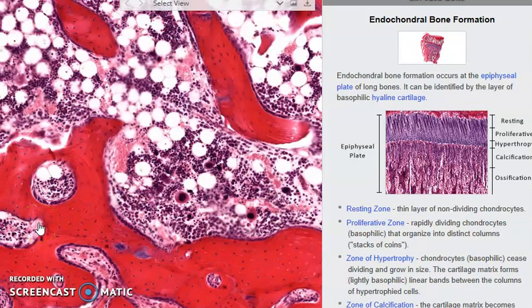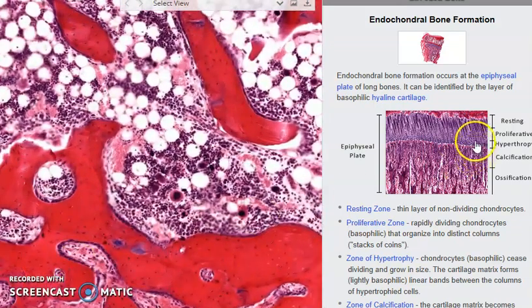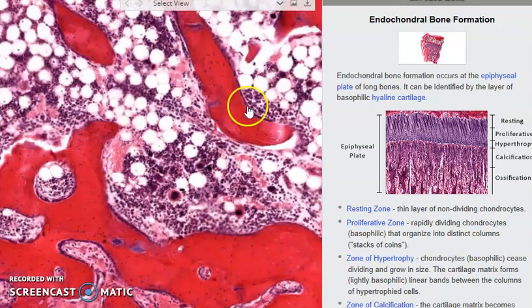So let's look at the histology slide. So this is the page that I'm taking you to. I'm cheating. It's actually the growth plate. And if I slide down or slide out, I have my growth plate actually down here. So this is the growth plate. We're actually looking up here in the slide, so the growth plate would be right there. And I just liked this slide better for the trabecular bone or the spongy bone than the other bone. So I'm going to zoom in.